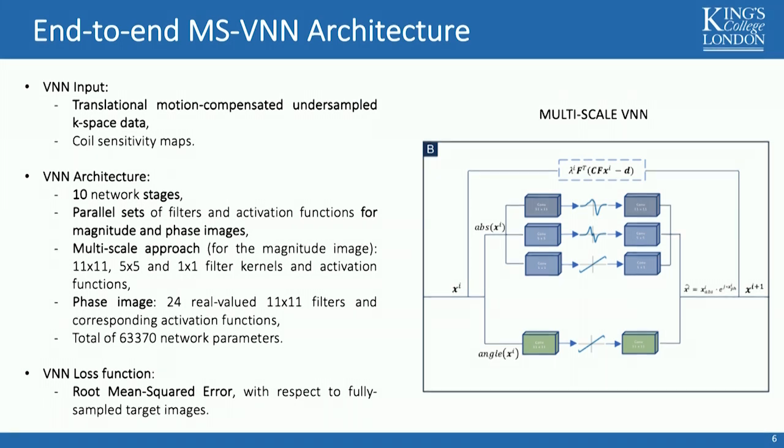And for the magnitude images, we use a multi-scale approach, where filter kernels and variational activation functions are learned.